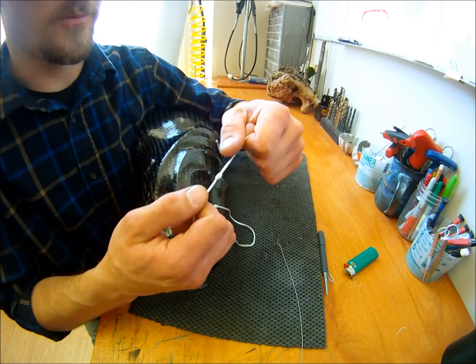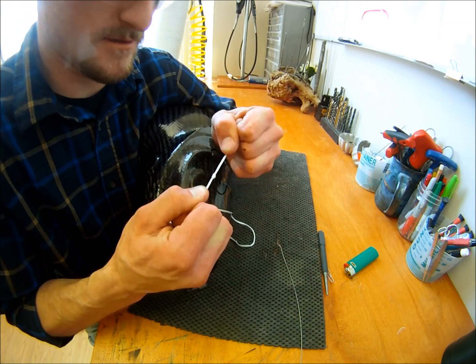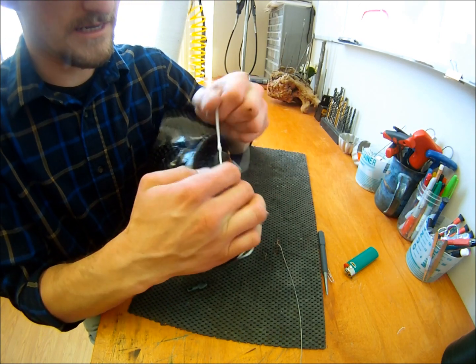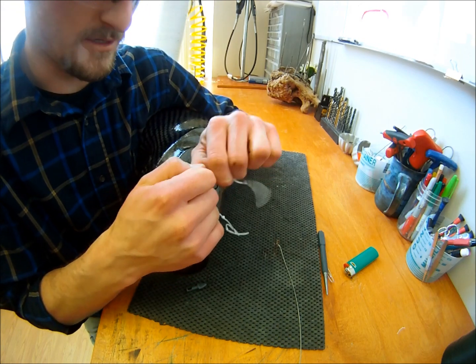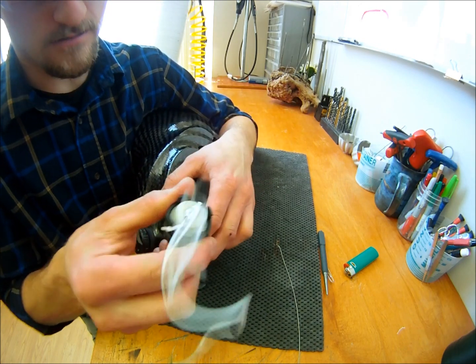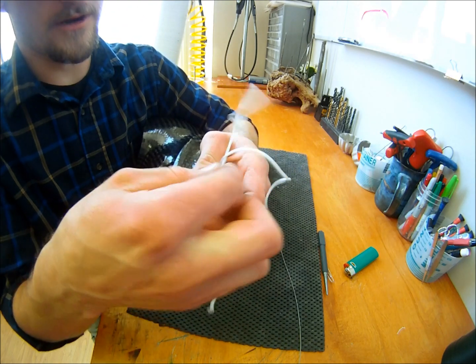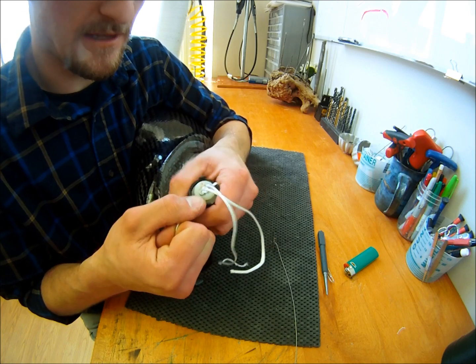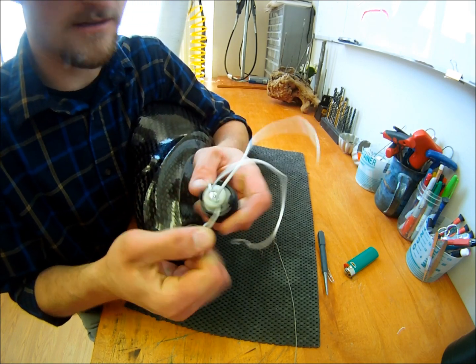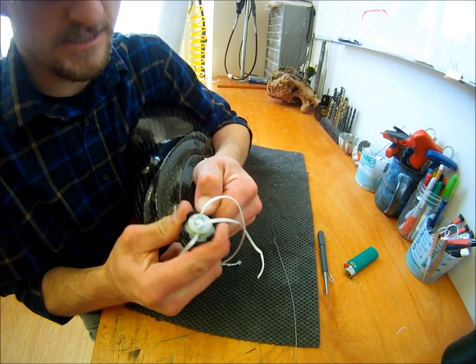And it's important to tighten these first. Make sure the knots are good and tight. Otherwise, you'll have a very difficult time fitting them into the recess on the bottom of the dial. So at that point I can pull these back. You'll pull on them slightly and they'll sink into the recess.